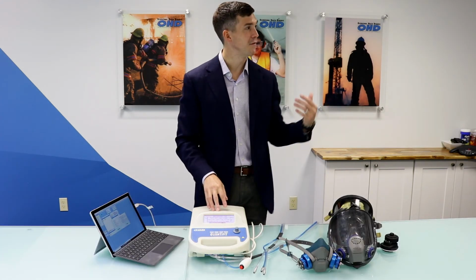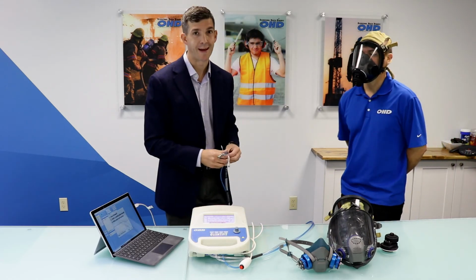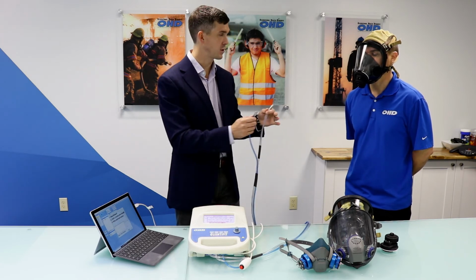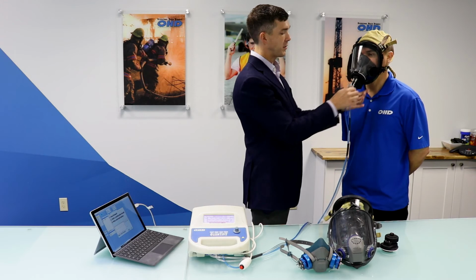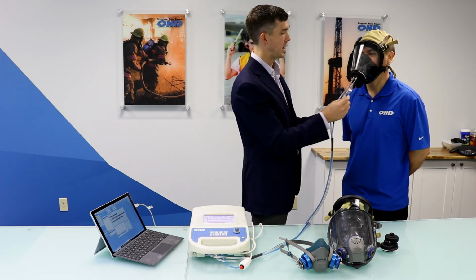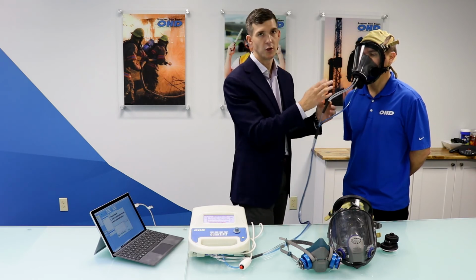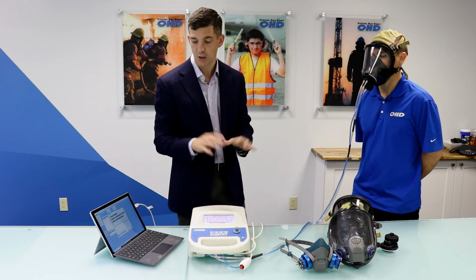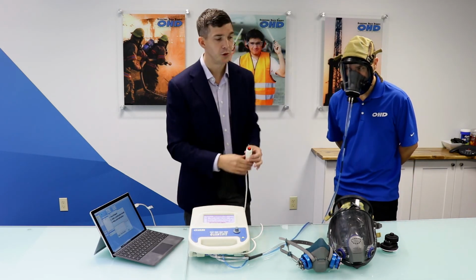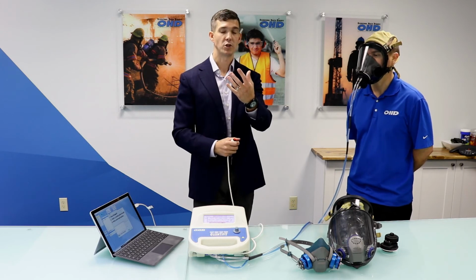What I'll do is have Stephen come over, and you'll hear the tone that's making sure the instrument is connecting. Face forward step, which we talked about earlier on the read-on, but first let's connect up our tubes to the adapter. Just like we talked about earlier, you want the two clear tubes to be together, single blue tube to be separate, so there shouldn't be any crossover between the tubes. Very clean, very easy. Now that we're ready to start, whenever Stephen's ready, he's going to face forward just like the instructions say.